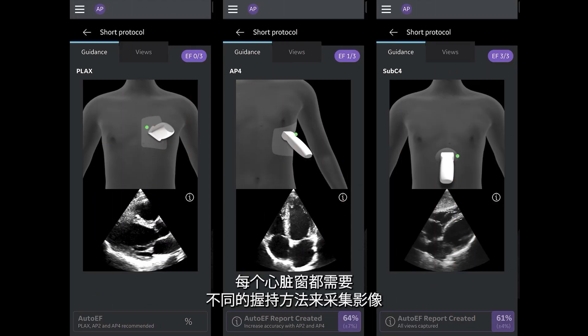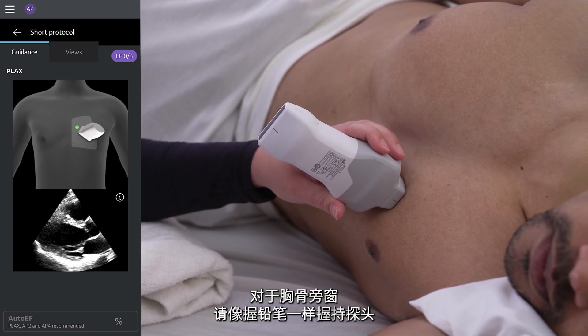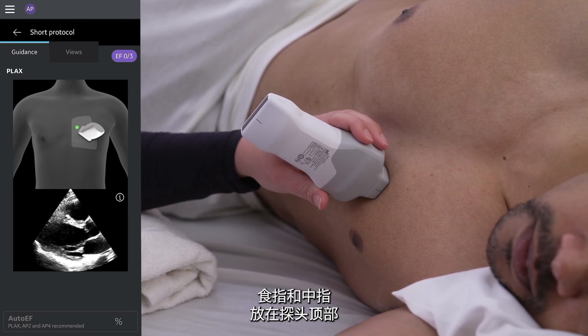Each cardiac window requires a different grip to obtain an image. For the parasternal window, hold the probe like you would a pencil, close to the face with your thumb on the bottom side of the probe and your pointer and middle fingers on the top.